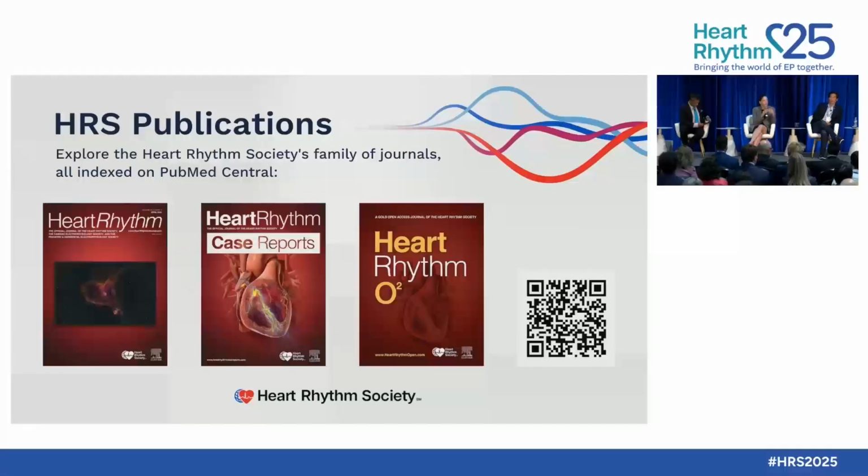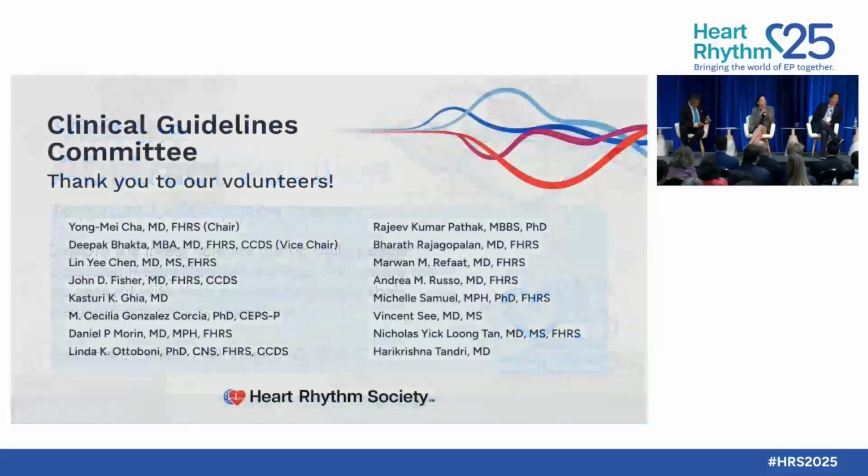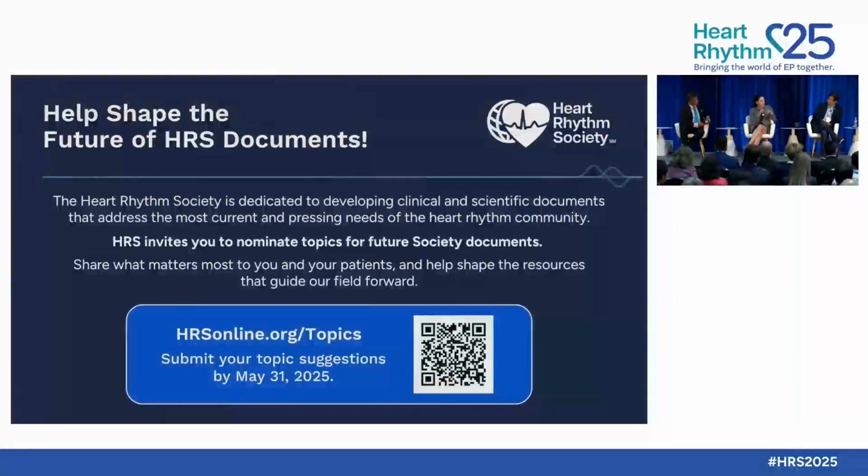As far as I know, your question is whether there is a correlation of this kind of mapping with in vitro optical mapping. To my knowledge, there is none, but I showed you some early studies showing fractionation at sites of mechanistic relevance to atrial fibrillation, where if you burn there, AF terminates, and you do see fractionated electrograms because of the animations that I shared with you.